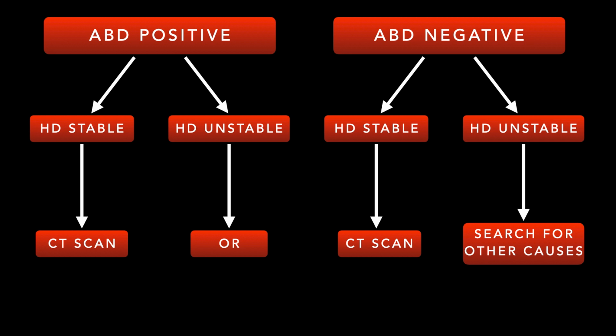And so, when we think about the abdominal portion, right, we have abdominal FAST positive, abdominal FAST negative, right? If the patient is hemodynamically unstable with a positive FAST, traditionally, that has meant the patient needs to go to the OR for an X-lap and an evaluation for where this hemodynamic instability is. Because the presumption is if it's positive FAST in the belly, they're bleeding into their belly, right? There's a problem there. Now, this has over the years become more of a nuanced question, right?